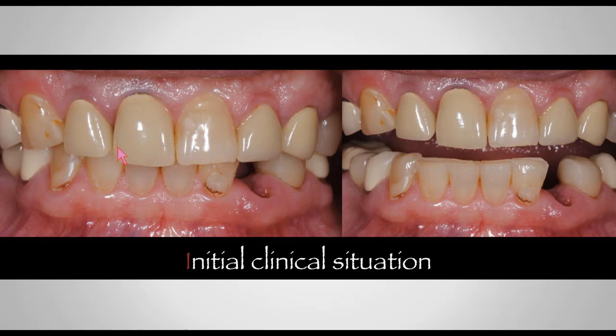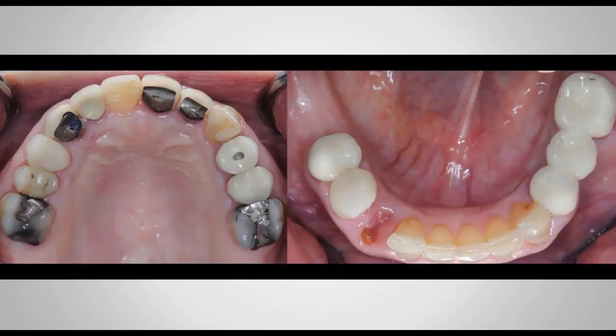So I was going to do the whole mouth, but I'm going to split this in first. I'm going to do the anterior guidance, and then I have my patients come back in a week, tell me how they feel with no posterior occlusion, and then I go ahead and do my posterior teeth. So I'm going to do the whole mouth, but not all at the same time. I'm just going to etch depending on the substrate that I have.